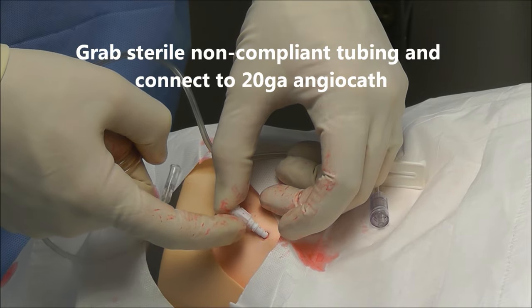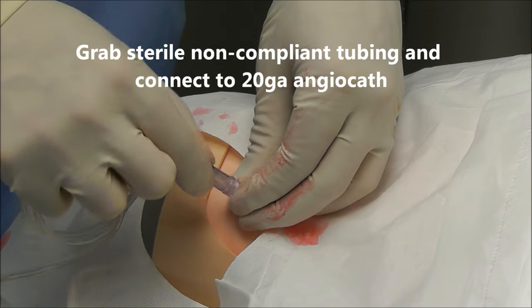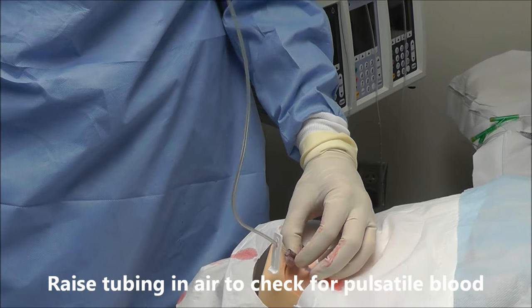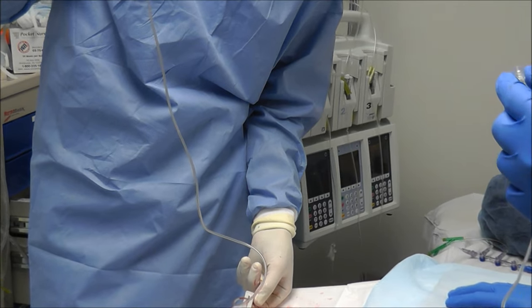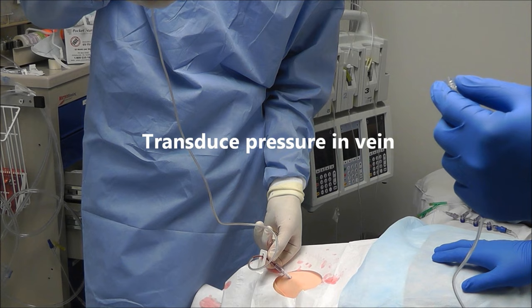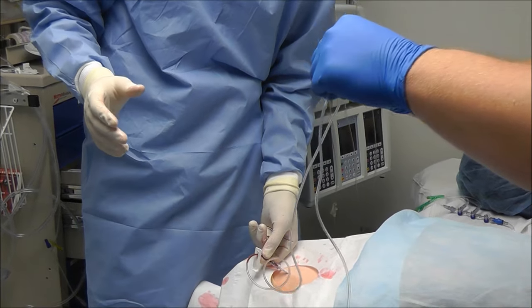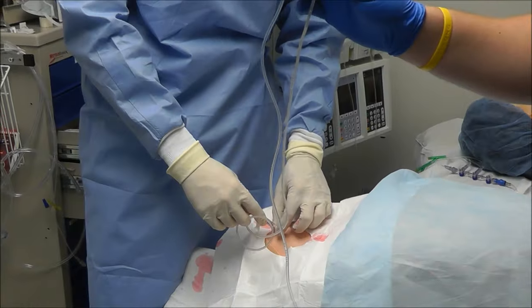Always make sure that you're occluded — including any kind of catheter directly into the vein so it's not open. Now I hook up my tubing here and I raise it up. That looks venous to me. If it were arterial, this blood would be coming up. One last thing you can do to really make sure this is truly venous is to transduce the waveform, and you need an assistant to do that. So I'm going to hand that to you — go ahead and hook it up to our transducer and we'll look at the pressure. Pressure's good, so this is venous.